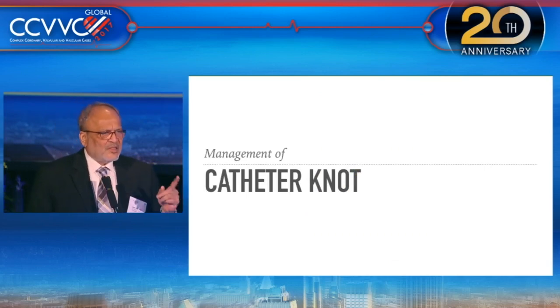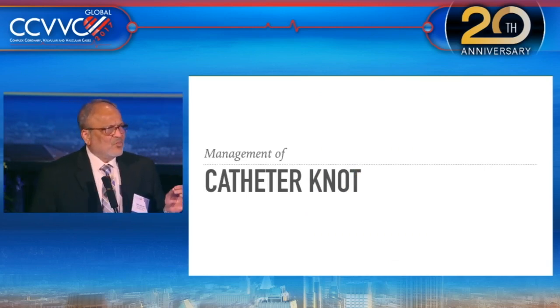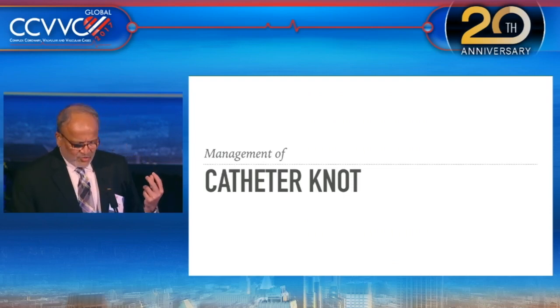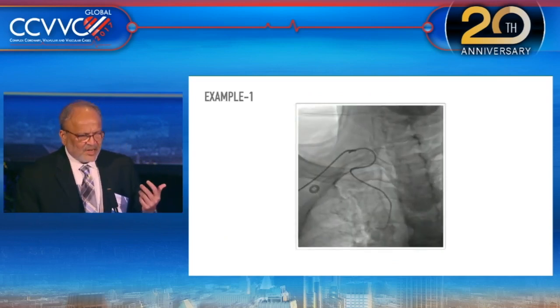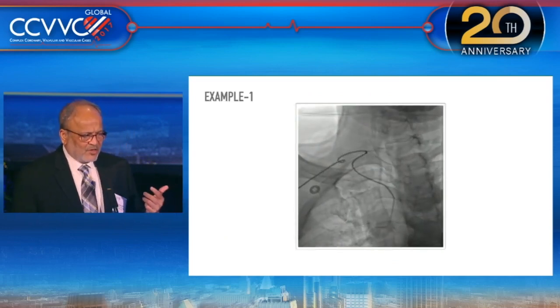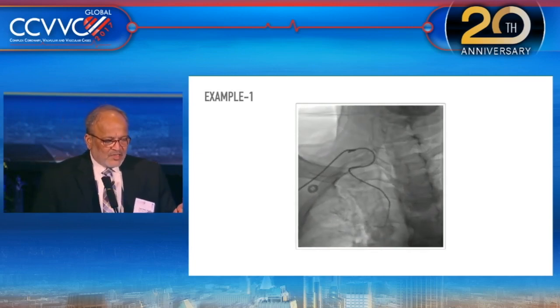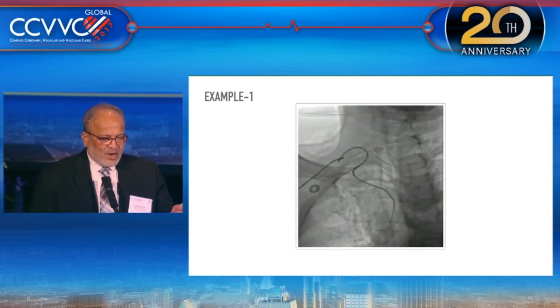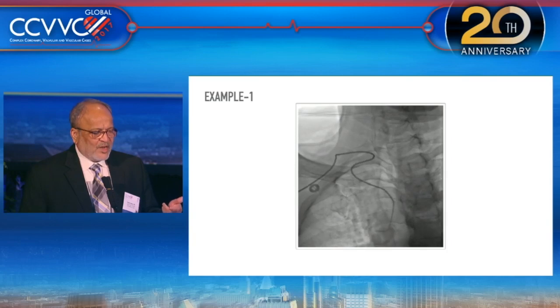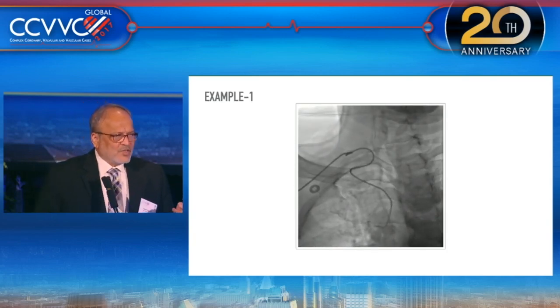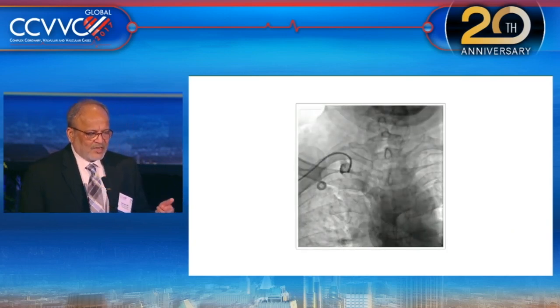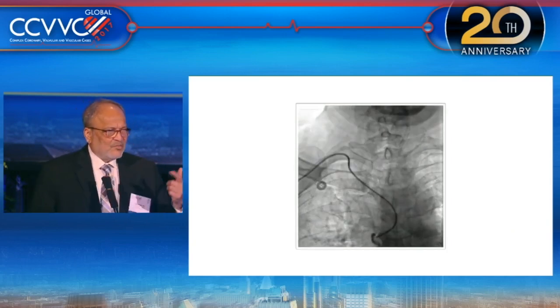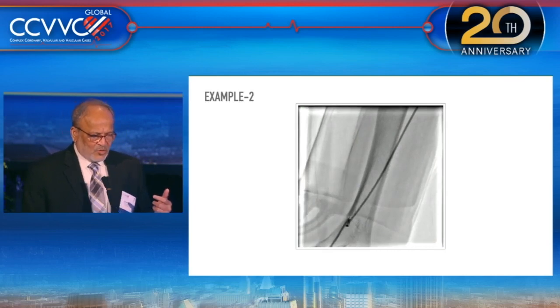Catheter knot is a problem because the radial is a small artery, and if there are very bad subclavian, axillary, or innominate tortuosities you can come across this type of catheter knot. Here you can see the distal part of the catheter is not moving. We could remove the knot using a wire inside, reduce the knot, remove the catheter, and demonstrate the complex tortuosity.